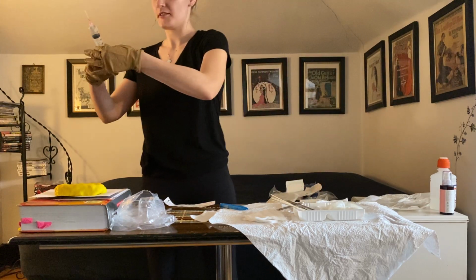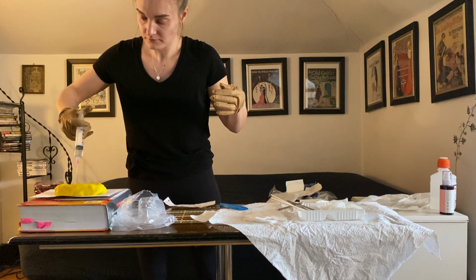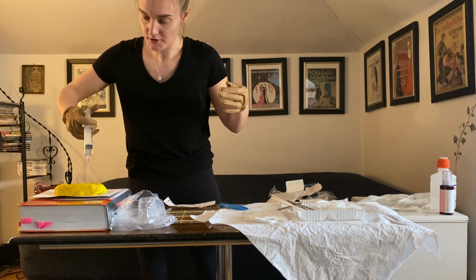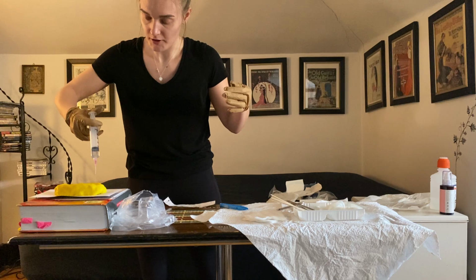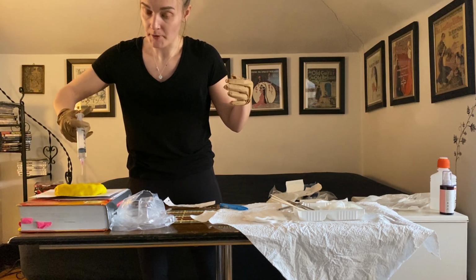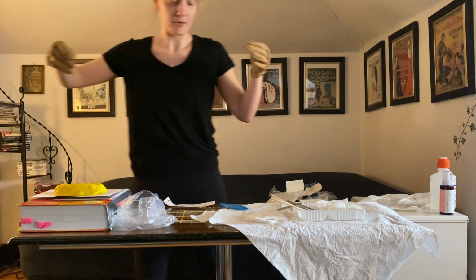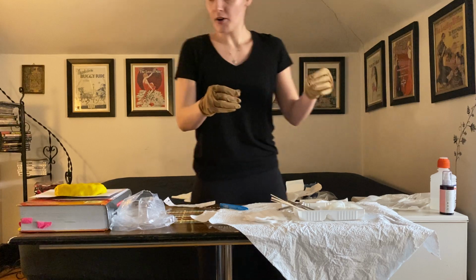And again, so I'm about 10 centimeters away. So just making sure that I'm not going past the peri wound there. And just for the purpose of the video, I'm not going to use the whole 10 cc's, but normally I would irrigate until it runs clear. I'm going to drop that. There's the garbage there. So now I'm just going to dry that.